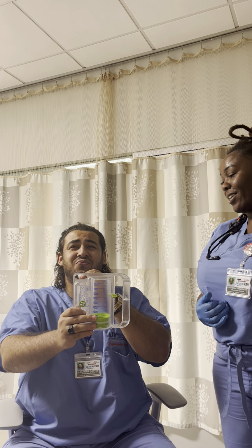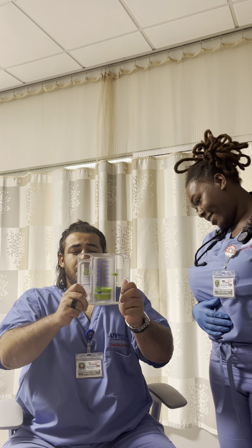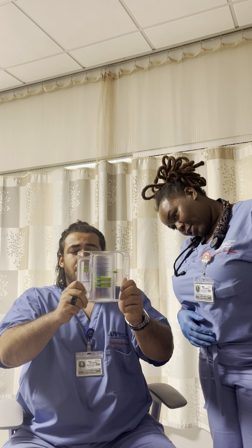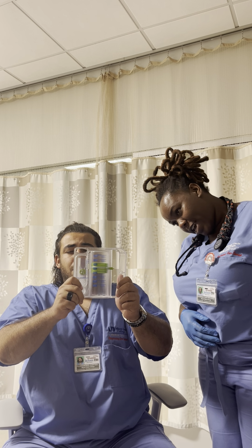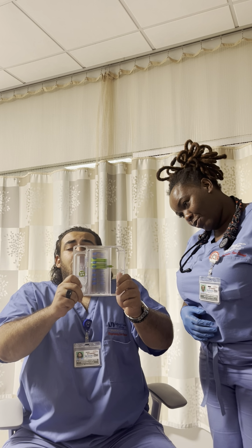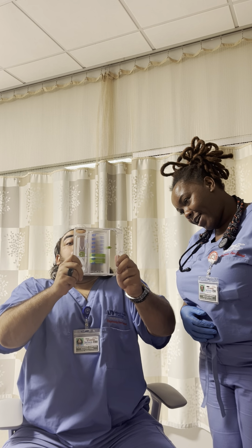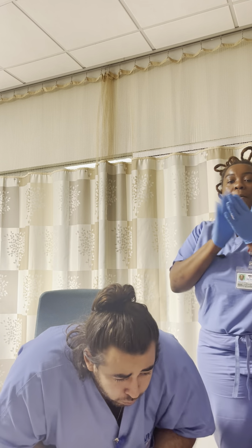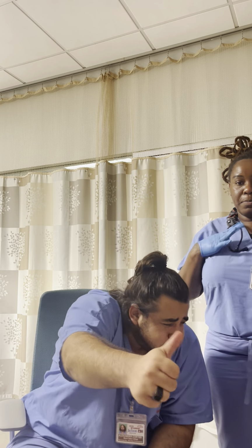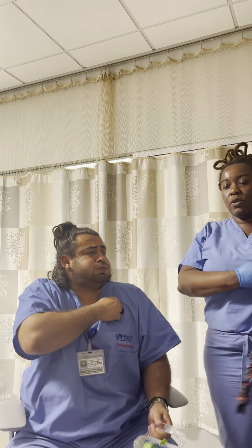Yes, good job. After a normal exhalation, not crazy exhalation, okay? Happy face in the mid. That's right, green piston on the happy face. You at the 25, hold it. 1, 2, 3, 4, 5, 6, 7, 8, 9. Patient has done a great effort, performed very well.